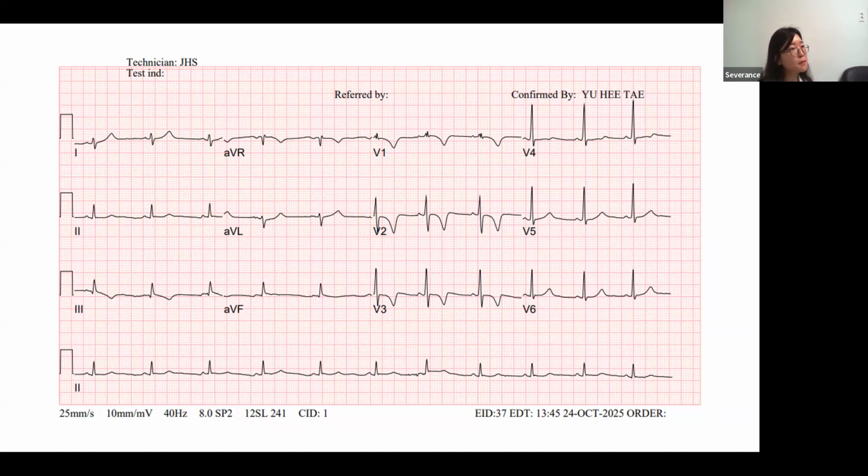Because for the last 29 years, including 30 years counting the gestation stage, her ventricular activation pattern was pre-excited, right? And we ablated it. Now it starts 100% through the AV node. That's why the activation and repolarization pattern changed, but it recovers.